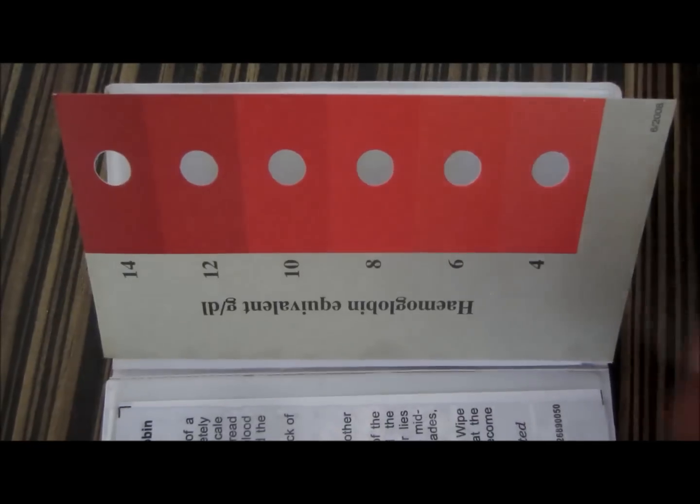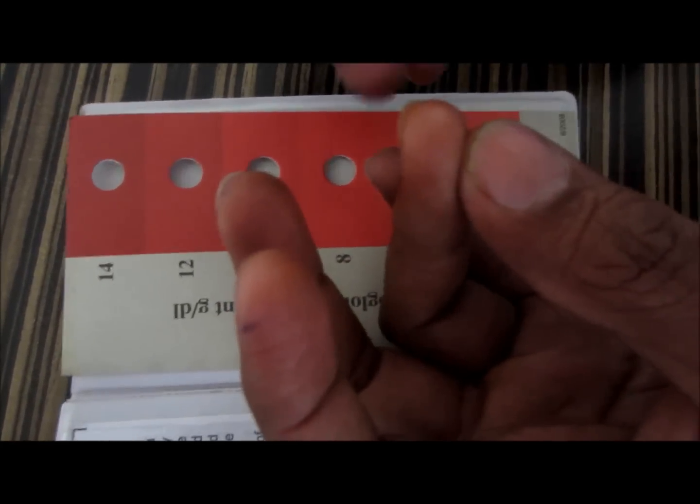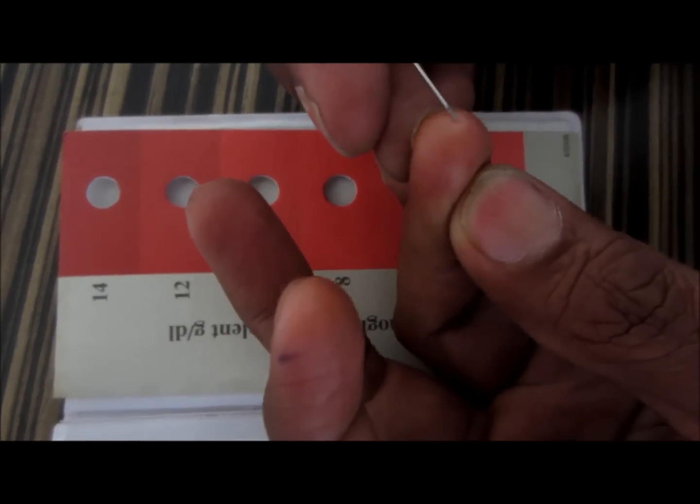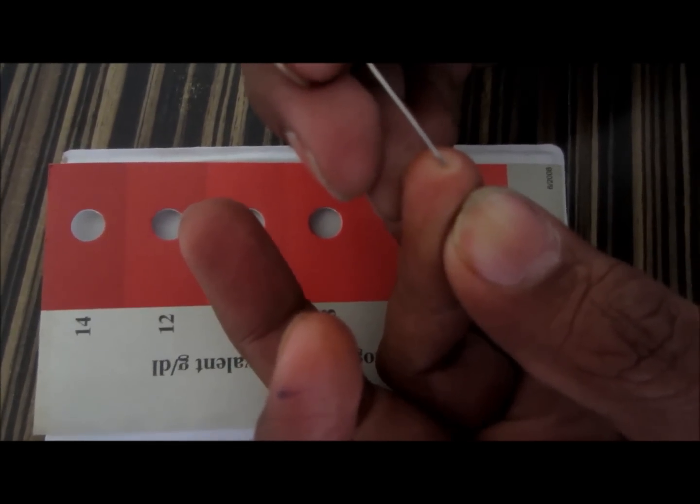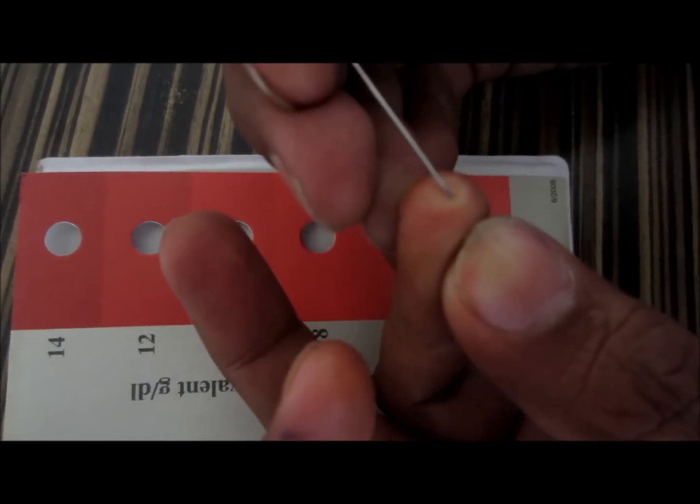Hi friends, this is a quick way to evaluate your hemoglobin in the blood. You need to have this paper with the color chart here. You can match the color of the strip to the blood, and you need to prick your finger.